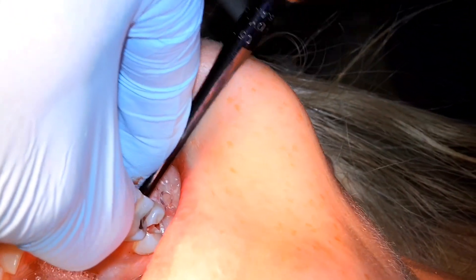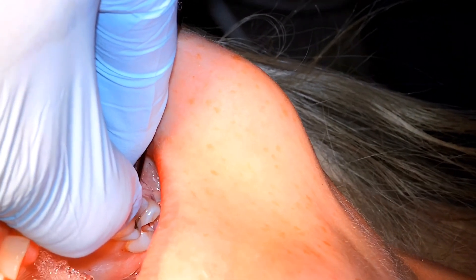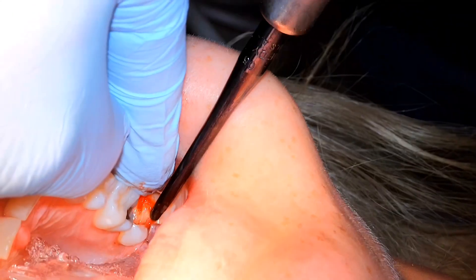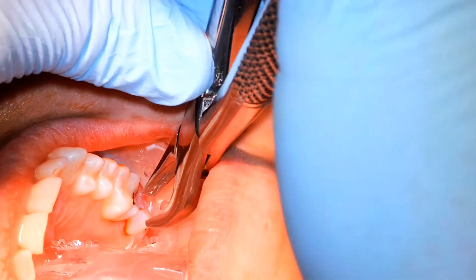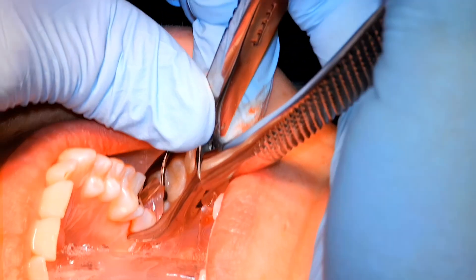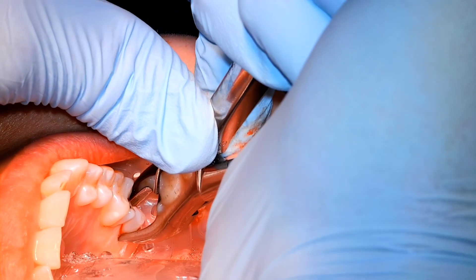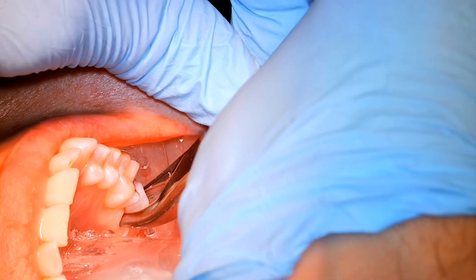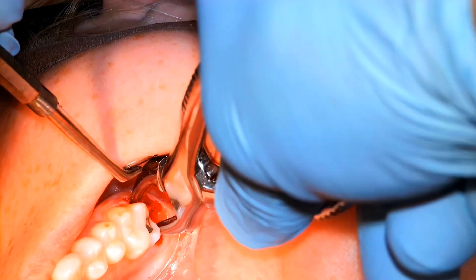I've basically separated the mesial root from the distal root. Going back to the mesial buccal with the luxator, just lifting up — and see that pops right up and lets loose. It's a long root. Now with the 76S forcep, we're grabbing the palatal root. We already luxated it early on, so now we just lean on it a bit. Rotation works really well with these — twisting — and out comes the palatal root.